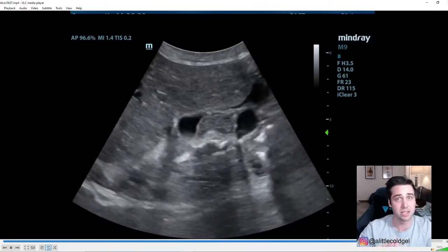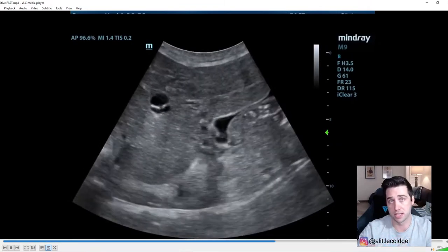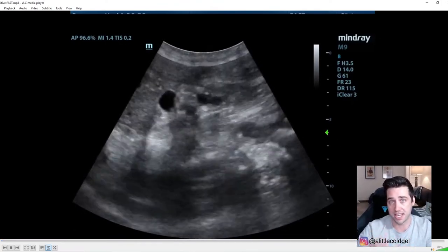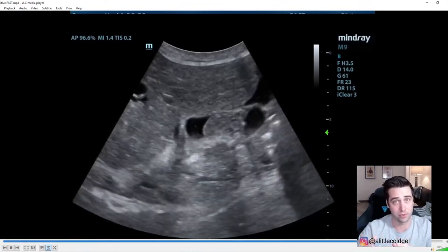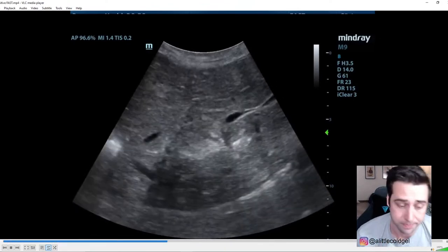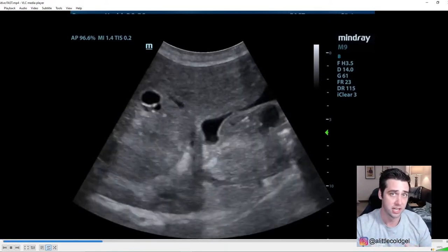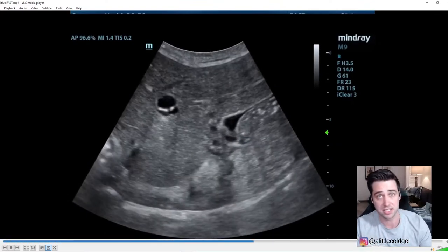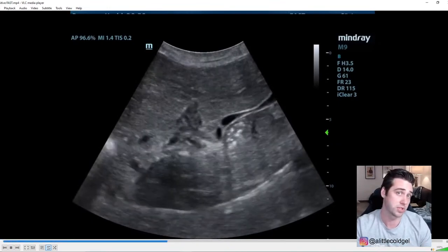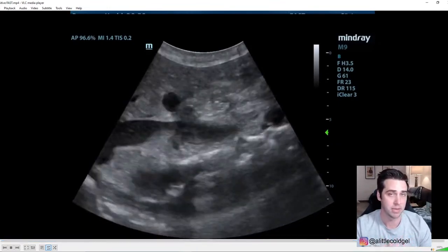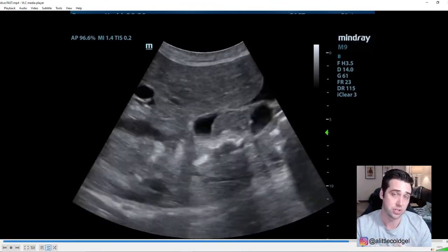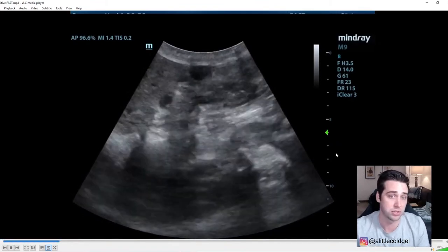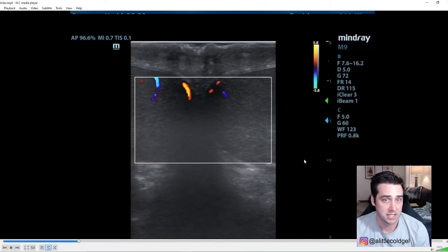A more subtle positive FAST shows just a small stripe of free fluid between liver and bowel — much harder to catch. In the right upper quadrant, you need to see the inferior pole of the kidney or the inferior pole of the liver to call it negative. In the left upper quadrant, fluid accumulates above the spleen first, so you need to see the interface between the diaphragm and spleen — if you miss that, you could miss fluid that's accumulated between the diaphragm and the spleen.